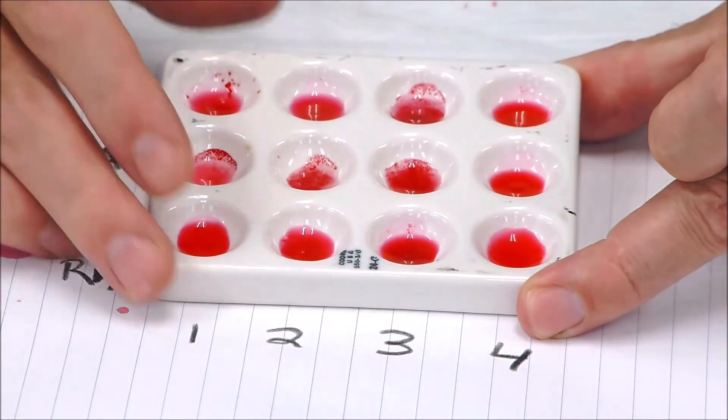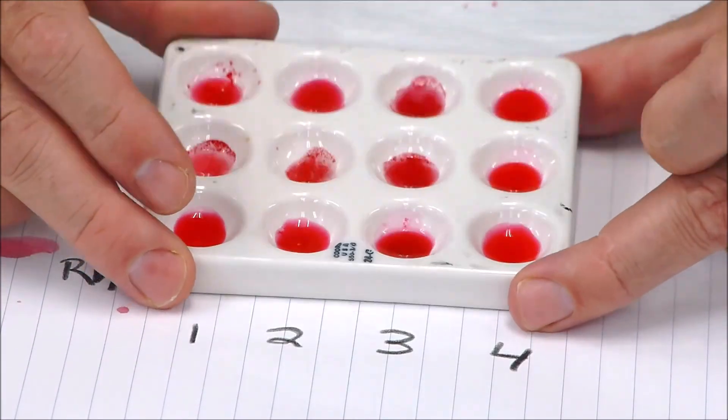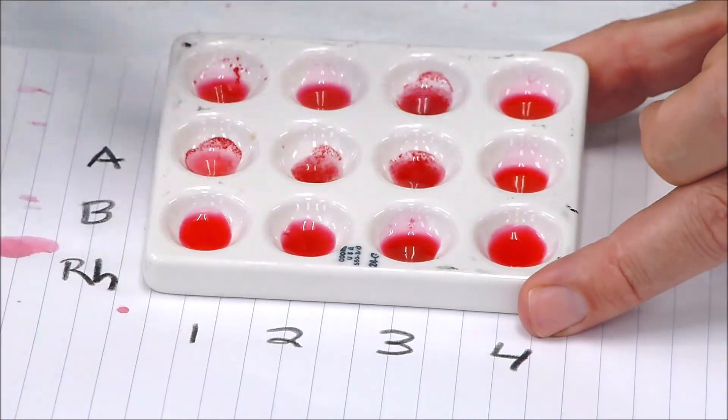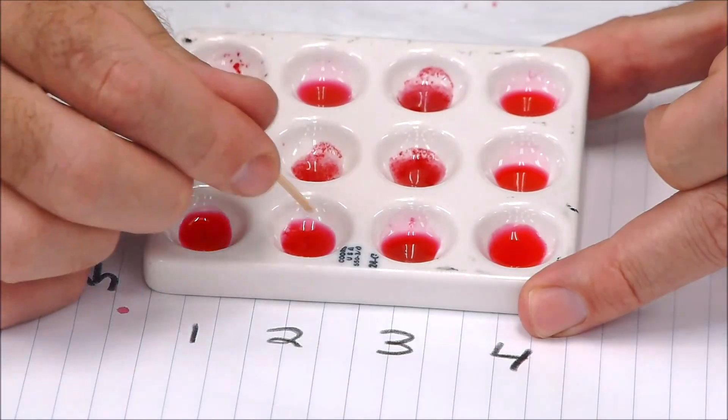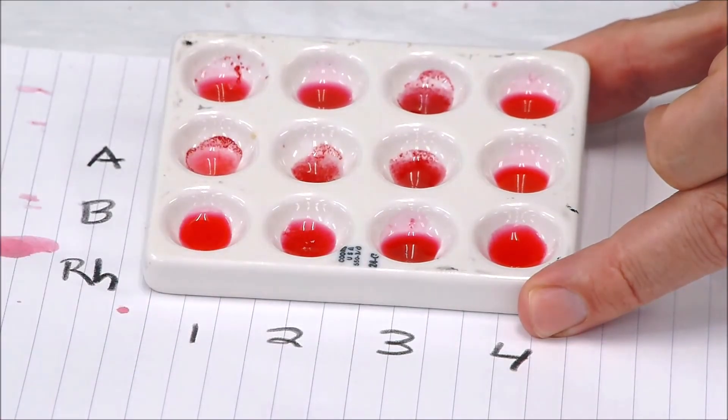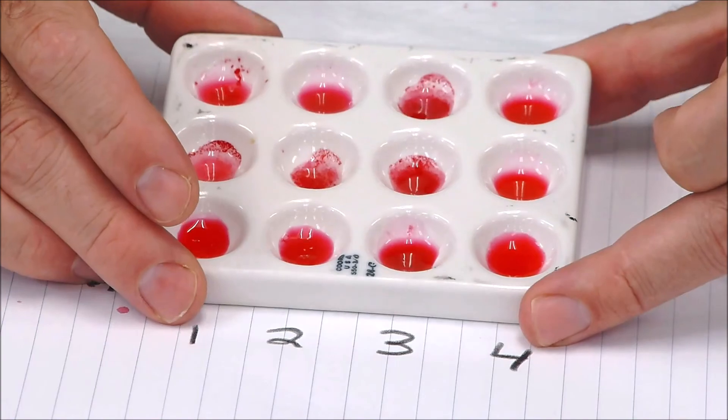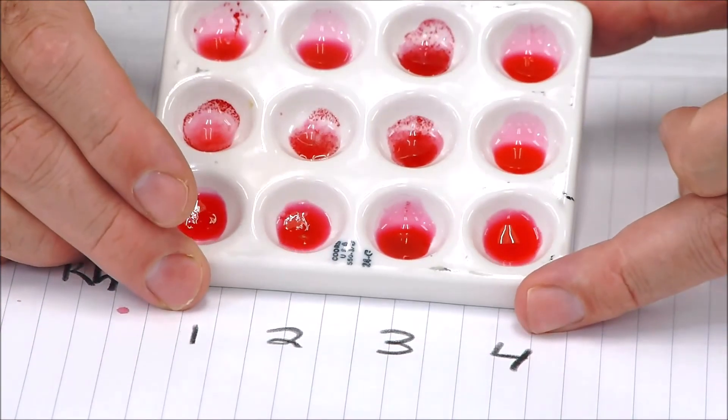Okay, for sample number two, you can take a look and see where do you see agglutination. And you may not be able to see the gelling going on, but I'll just tell you that the Rh down here has gelled, okay? So figure out what the sample is there.